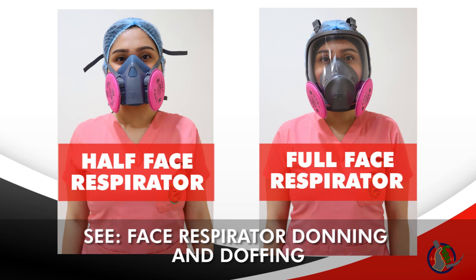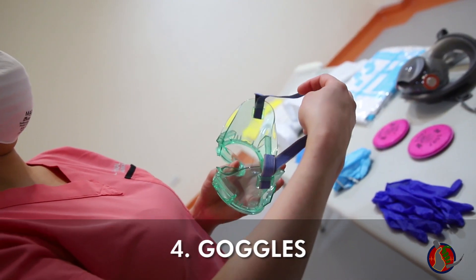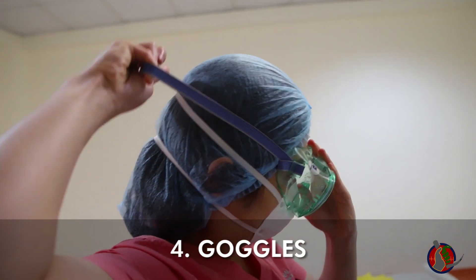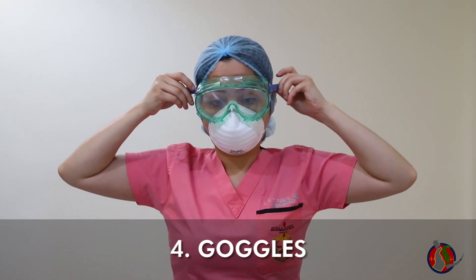A half-face or full-face respirator may be donned instead of an N95 mask at this time. See the face respirator donning and doffing video for details. Put on your goggles. If you're wearing eyeglasses, put eyeglasses on first before your goggles. Skip this step if you're using a full face respirator or PAPR.